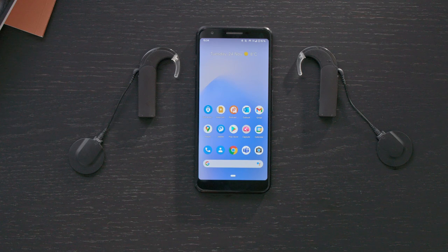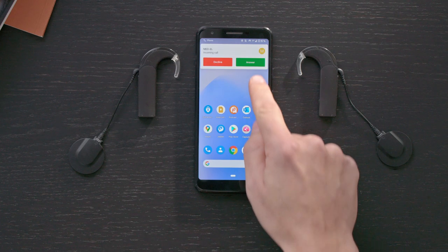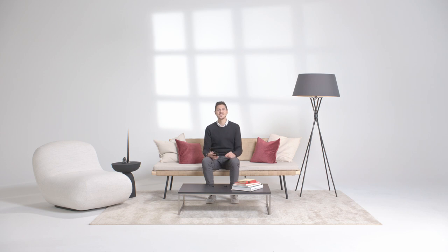To receive a phone call, simply accept the call on your phone. And that's it. Speak into your phone's microphone and enjoy your conversation.